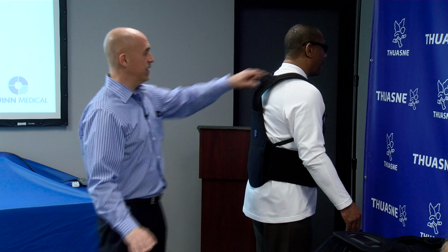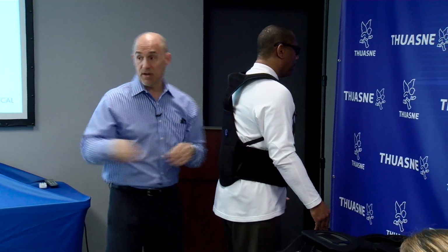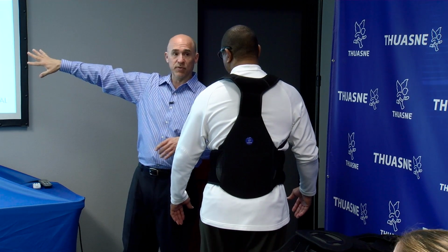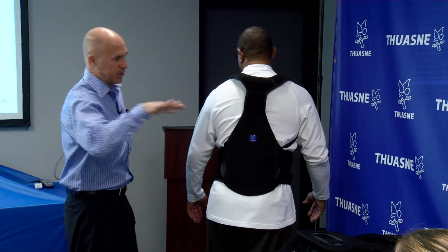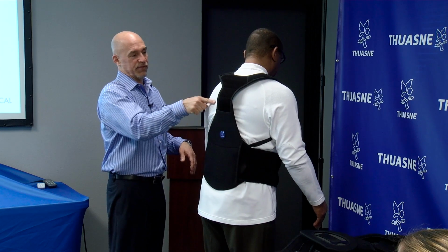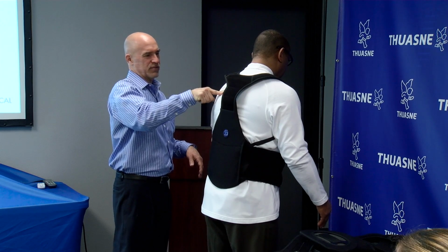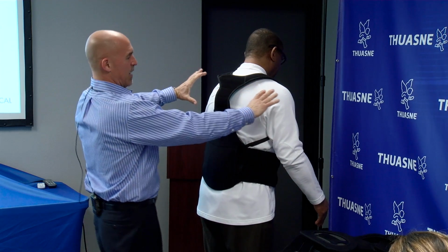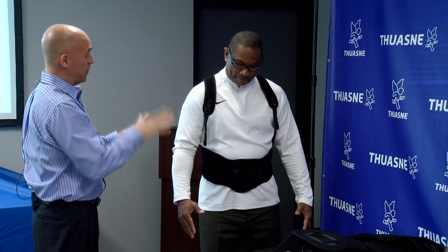All right, so this part of the brace, the middle of the thoracic section, is going to go right at the scapular spine level. Maybe you can peek over here so you're seeing the same thing they are. So scapular spine, that's your shoulder blade, the bony protuberance that comes up. The way to find that, you can do one of two things. You can find it just by running your hand up. You're too muscular. You're hard to find. So right about there on Chuck, or you can just eyeball mid-shoulder and then put this right in the middle.